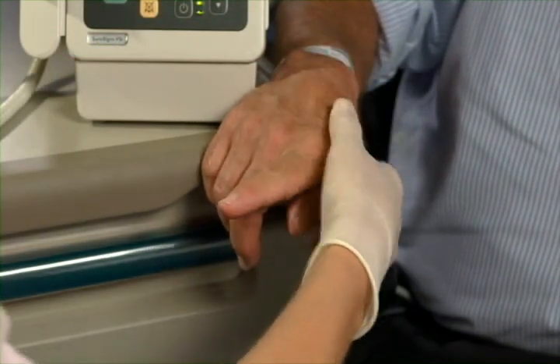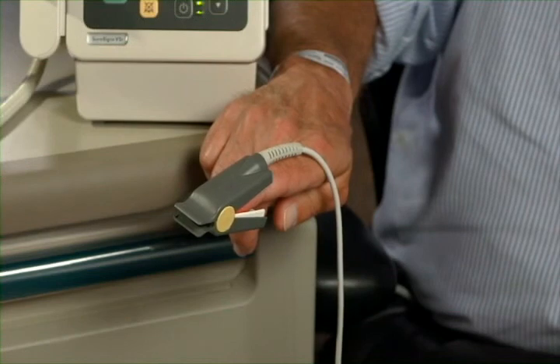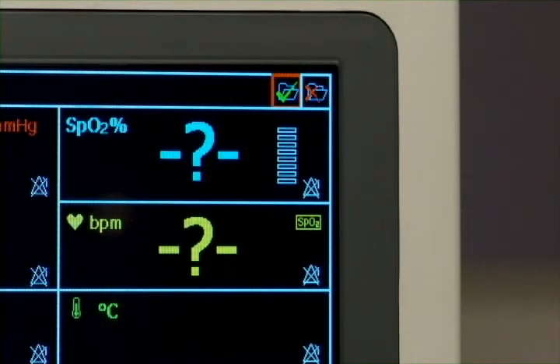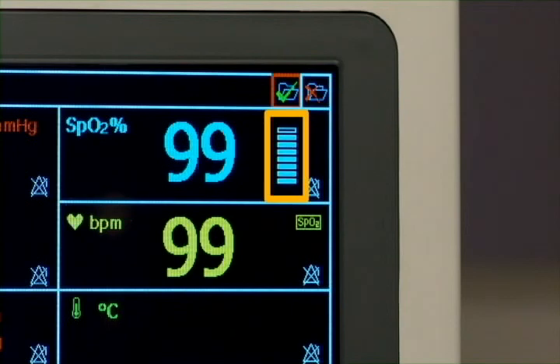When measuring SpO2, the most important consideration is to pick a sensor site with brisk arterial perfusion. It's also important to avoid using a limb with an NBP cuff. In a few moments, oxygen saturation and pulse rate numerics appear. If NBP is selected as the heart rate source, pulse rate will not appear. The perfusion indicator bar is a signal quality indicator for the SpO2 measurement.